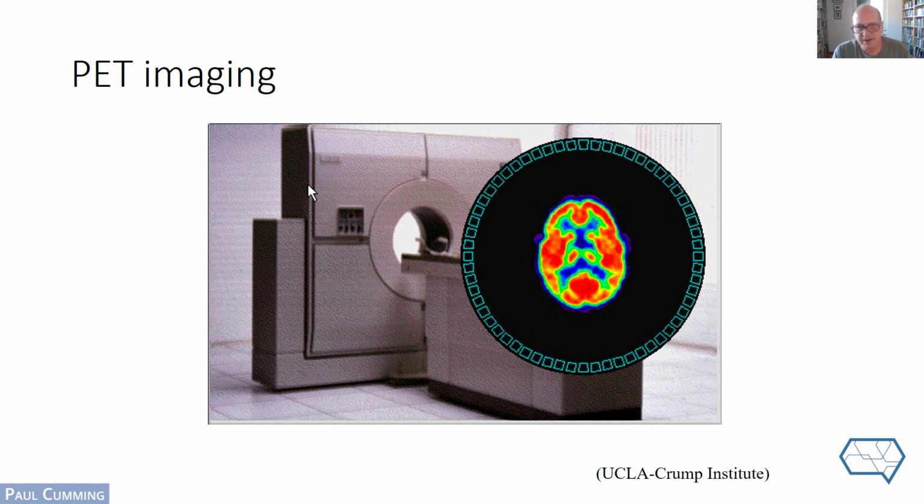Fluorodeoxyglucose is the most widely used tracer for molecular imaging in brain because it's so darn useful. Fluorodeoxyglucose contains fluorine 18 in its nuclear medicine application, and otherwise contains a derivative of glucose that behaves much like natural glucose, but carries with it the radioactivity from the fluorine 18. And so it allows you to track the metabolic activity in brain. Next slide.